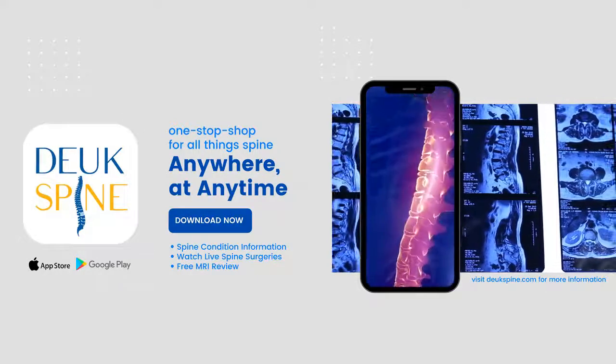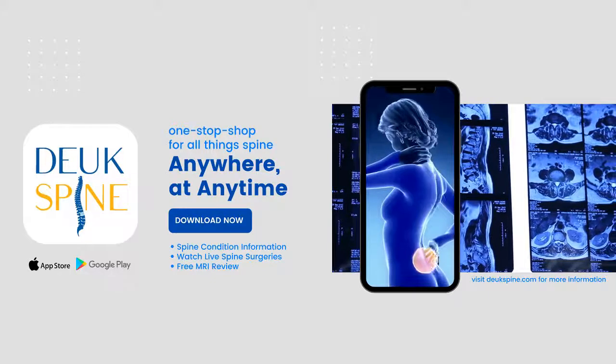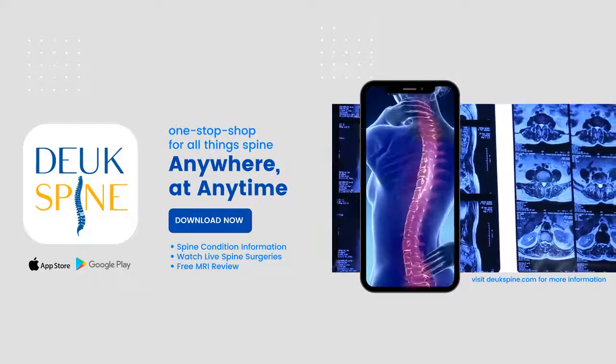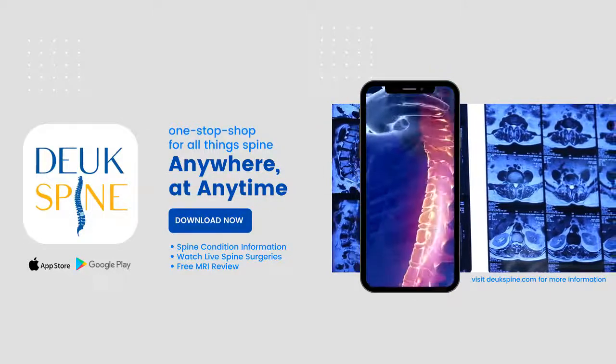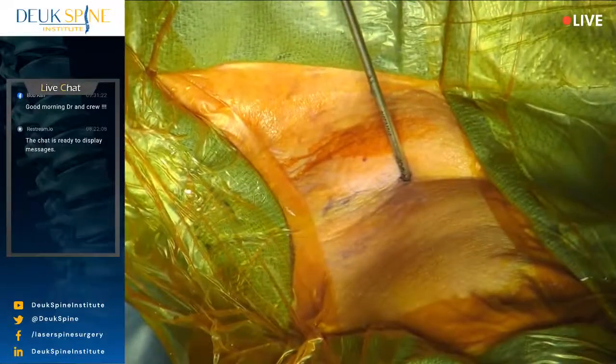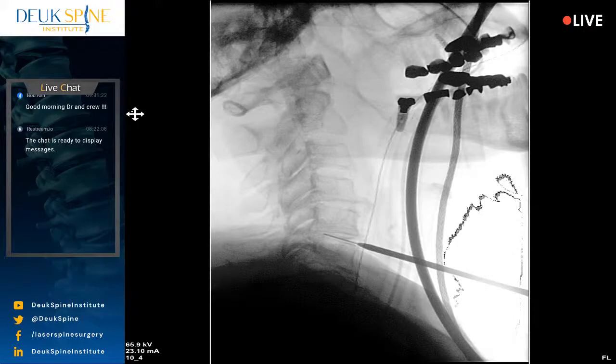So we've placed our dilator through the skin incision. It's down on the spine. You can see it on the lateral view. We're about to enter the disc. I already checked the AP view to make sure that we're in the middle of the spine, and it is. So I'm kind of twisting the dilator to get it to enter the C5-6 disc from the front. Now the front of the disc is not where the problem is. It's in the back of the disc. And that's where we're headed, is the back of the disc.